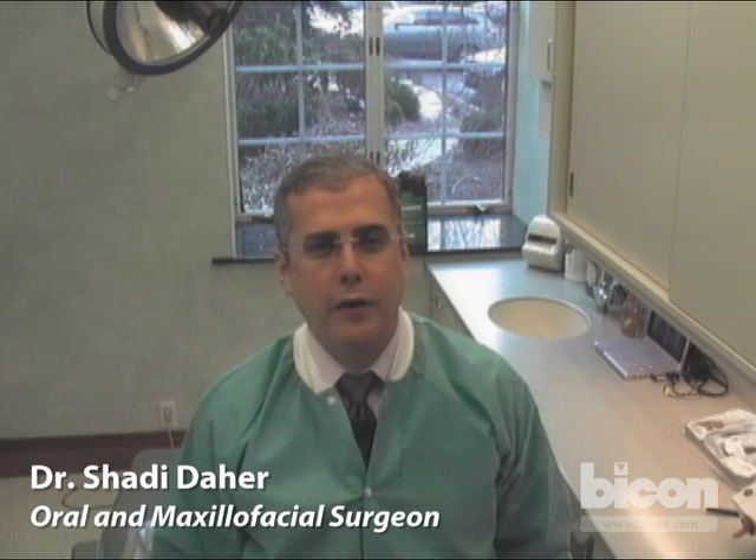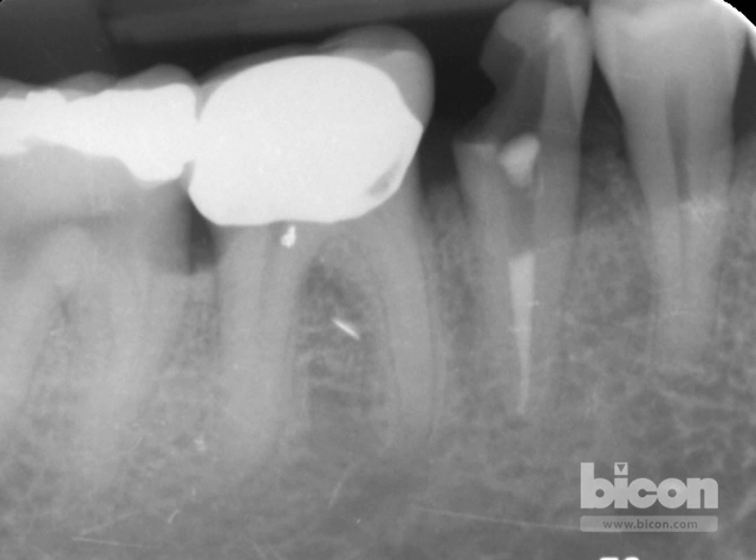A periapical radiograph of the mandibular right second bicuspid shows that the five by eight millimeter short implant will fit to perfectly obliterate the entirety of the socket after removal of the root. The plan initially is for an atraumatic extraction of this bicuspid, which is probably the more difficult part of the entire procedure. Removing this tooth will be the challenge for the afternoon.